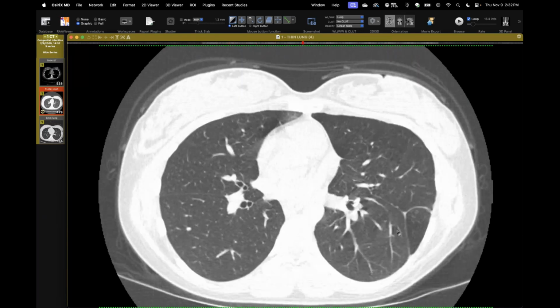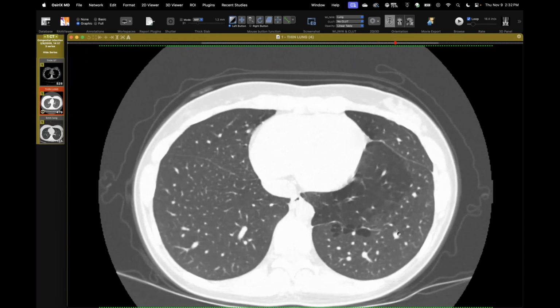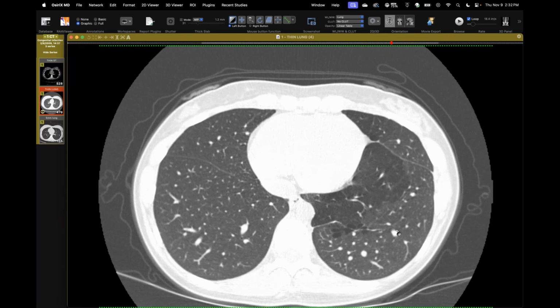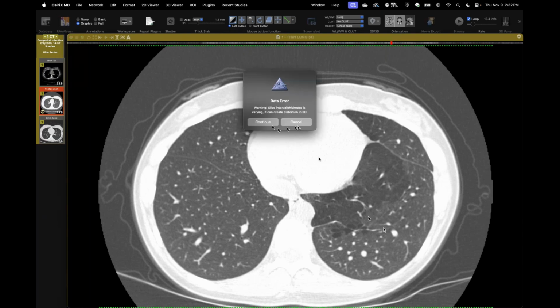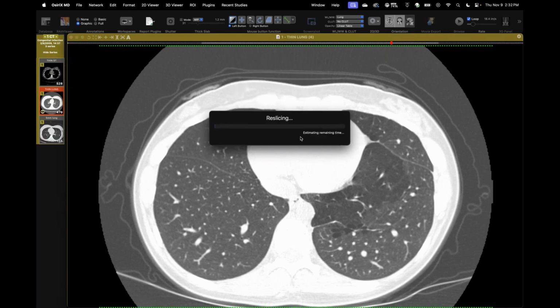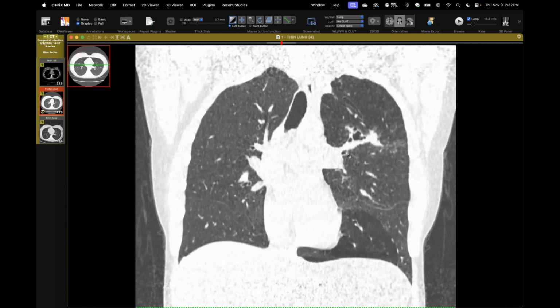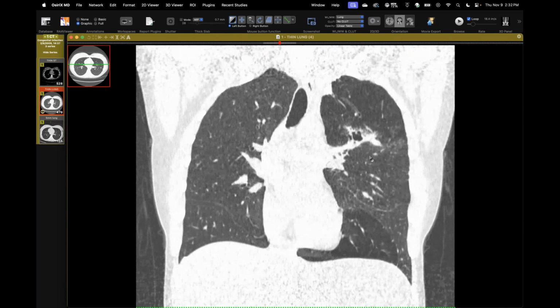I've not seen bronchial atresia. We always think of it as a don't touch lesion. I've not seen it lead to an infection, and I don't know if they just happen to get infected in that region. But it seems to me it's right where all of these blind ending bronchi are. So maybe the bug just got in there and found a nice place to set up shop. I've seen sequestrations get infected, but I've never seen bronchial atresia cause an infection.